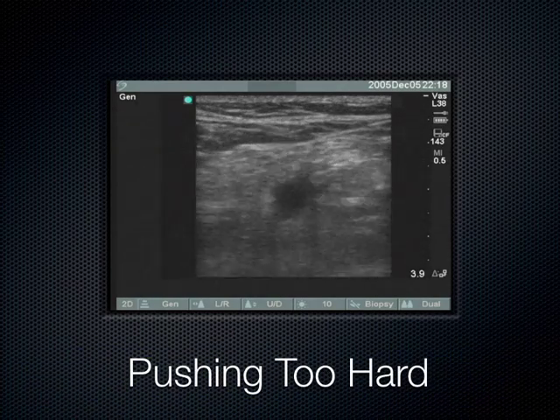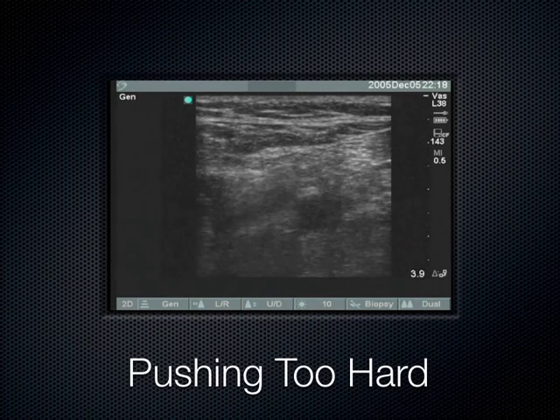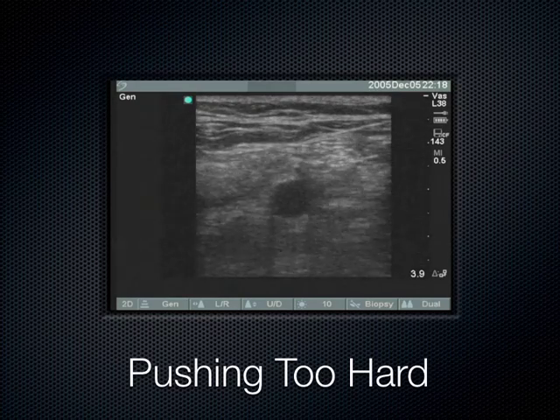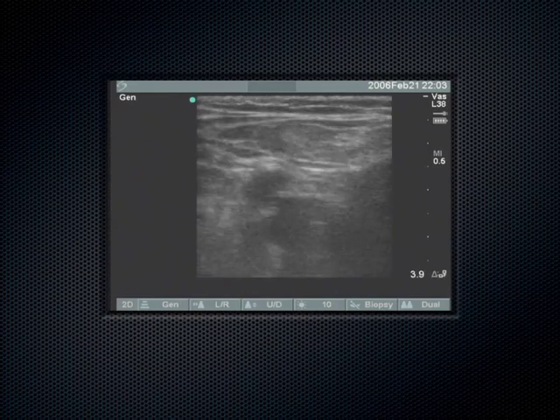You're like, "Where's the vein? Where's the vein?" I'm like, "Whoa, whoa, ease up a little bit, man. Pump the brakes." And then you can see the vein pop right open. Okay. So a lot of that is technique. You'll get the hang of that as you move through the rest of your stations today.